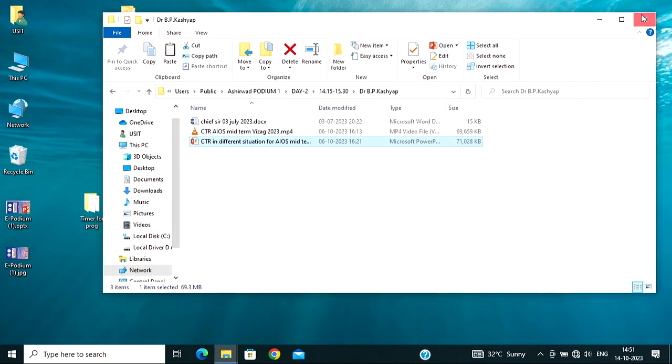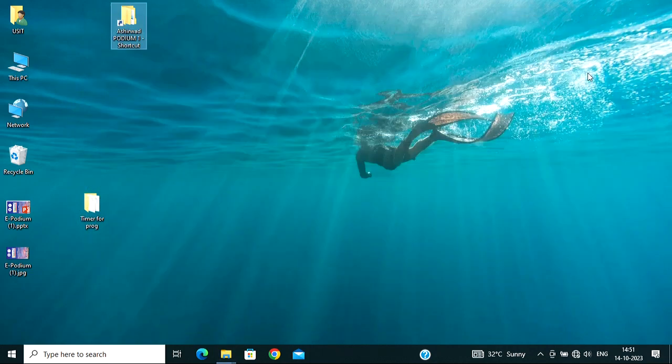Just one question to Dr. Satyamurthy. Do you use these preloaded CTRs in your cases? No, earlier I used to use these metallic CTR injectors, but a lot of visco used to come out in the next cases. So that's why now I do it manually, similar to what sir showed. Okay, simple, I have no manual idea.